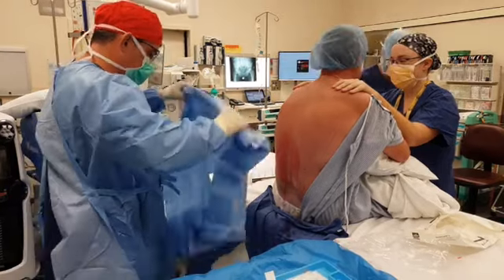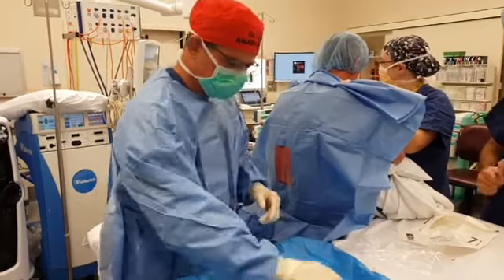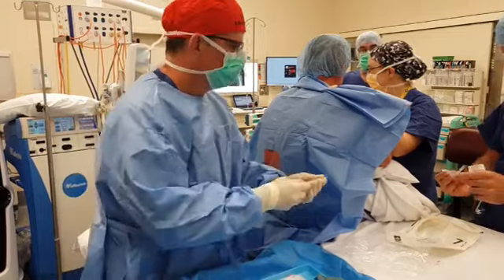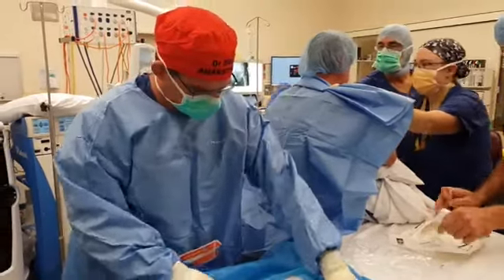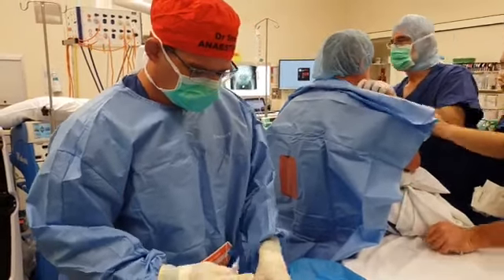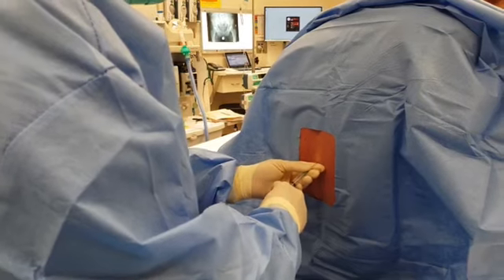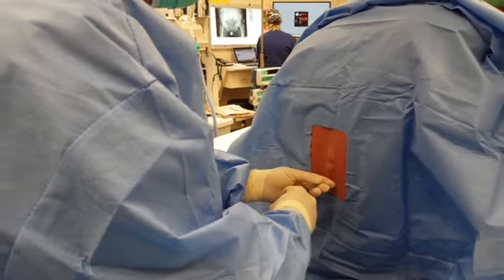You remember having a fall and hurting your hip? Yeah, 12 months ago. So this part is local anaesthetic for the skin. There's a little bit of local anaesthetic for the skin here, and this numbs it. So it's just going to numb the skin for where the spinal goes in.